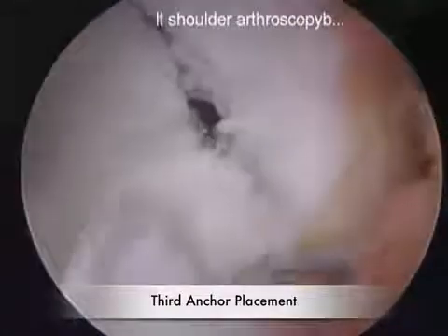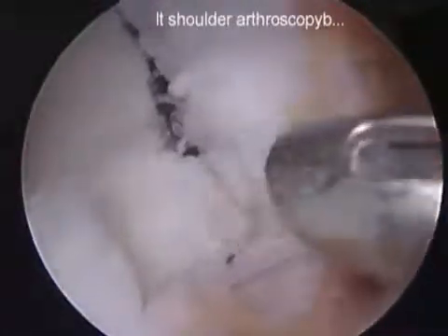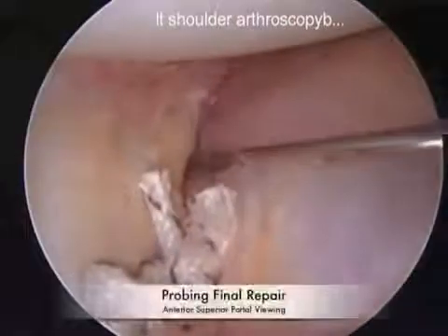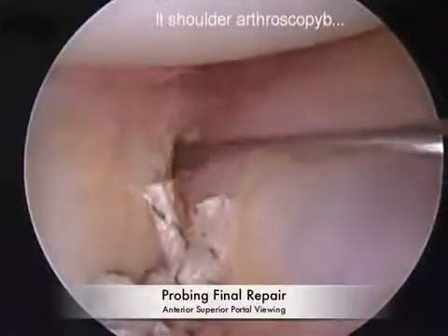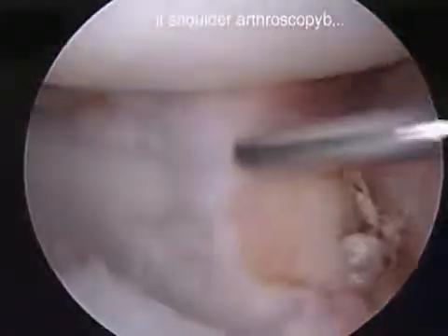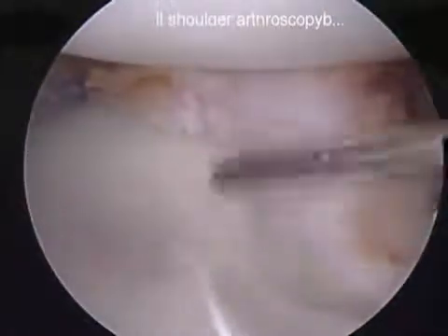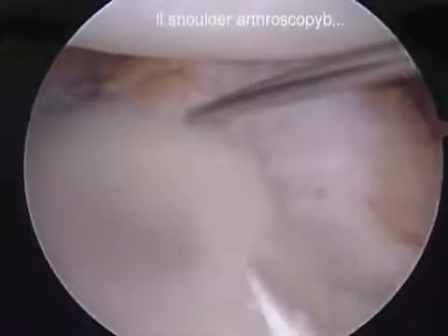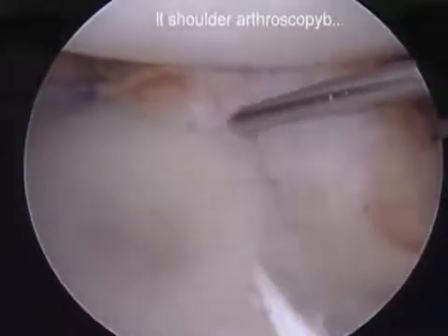The third anchor is placed just above the bony Bankart fragment to further secure the repair. Two additional stitches are passed in a simple configuration, and the knots are now tied utilizing standard suture management and arthroscopic knot tying techniques. Here you see the final repair from the anterior superior portal and the posterior portal as well.